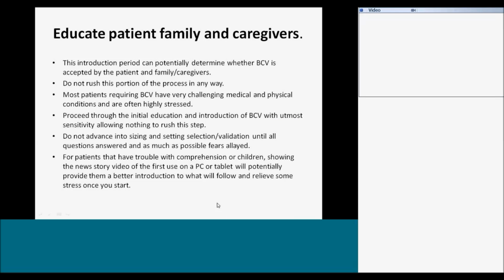Patients that have trouble comprehending, there's a video out on YouTube. If you look up, I believe, Hayek and Buffalo in the same search on YouTube, you'll find a video of the very first use. I have that video where it can be downloaded. So if you contact us, I can get you that video. I've actually put it on my phone, and for kids that have been anxious, I've played that video for them.